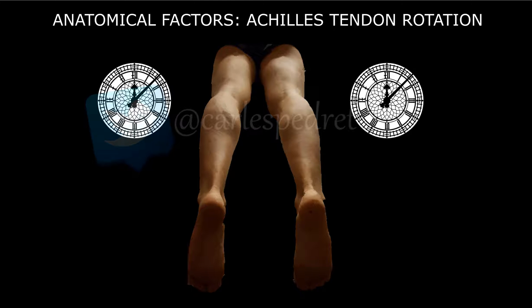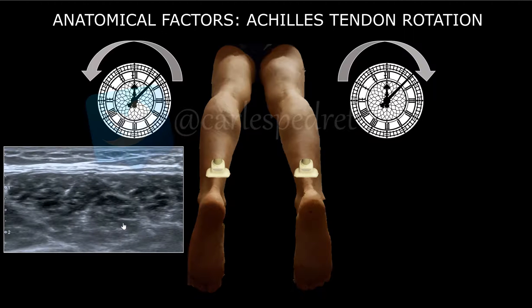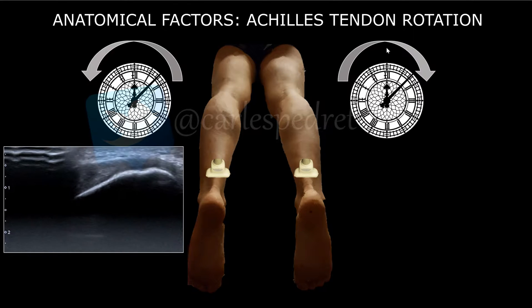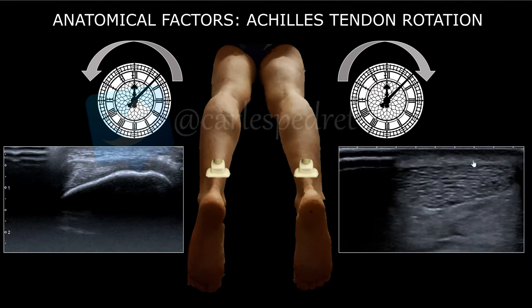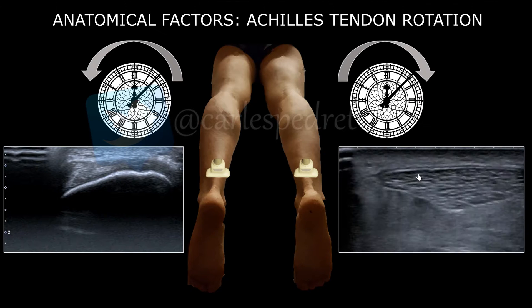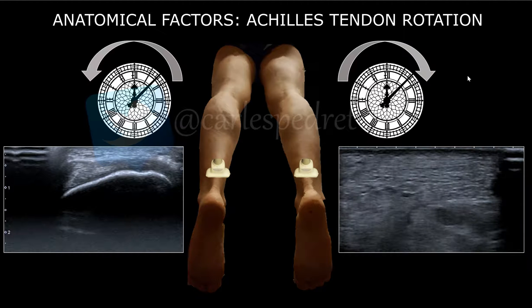For example, the left leg rotates anti-clockwise and the right leg rotates clockwise. As you can see in the video, this part is moving and making a rotation in the anti-clockwise direction for the left leg, and the right one is moving in the clockwise direction. It's quite difficult to see if you don't normally work with ultrasound, but you can follow the rotation all the way to the calcaneal insertion.